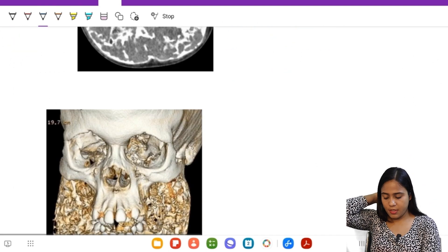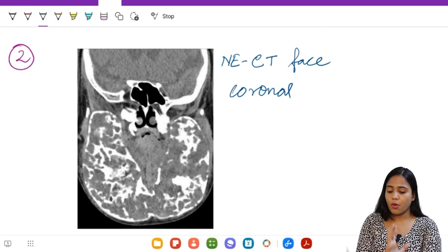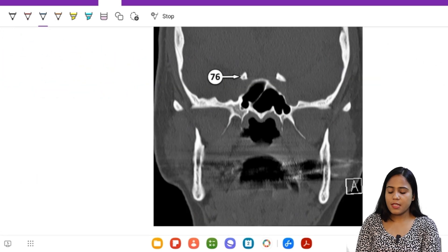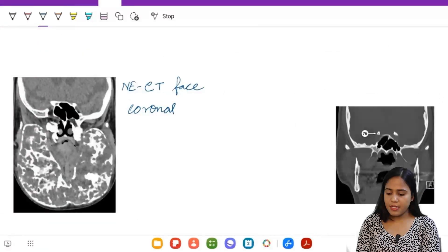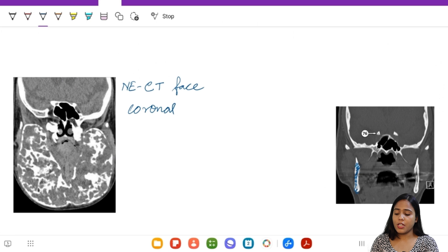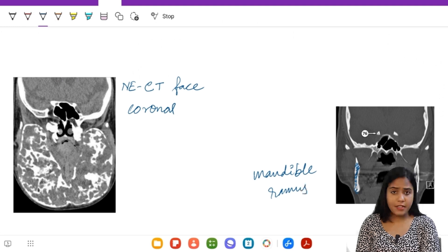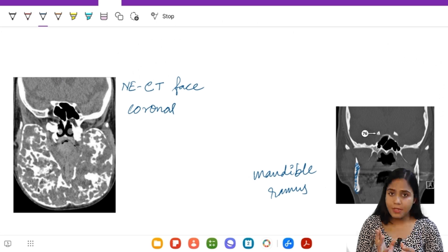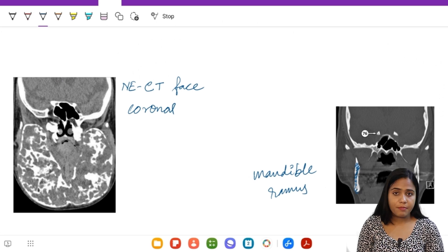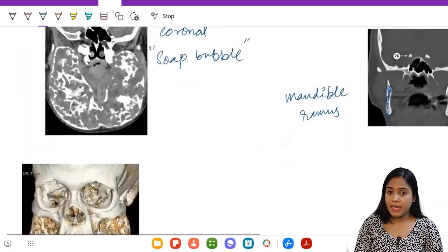There is also a 3D image here. Let's compare this with a normal coronal CT of the face. Please compare both sides - this bone which I can't see in our pathological picture is the mandible, specifically the ramus of the mandible. We cannot see it here. Instead, what we can see are bilateral hemimandibles that appear expansile, thick, and multiloculated, giving rise to a soap bubble appearance.